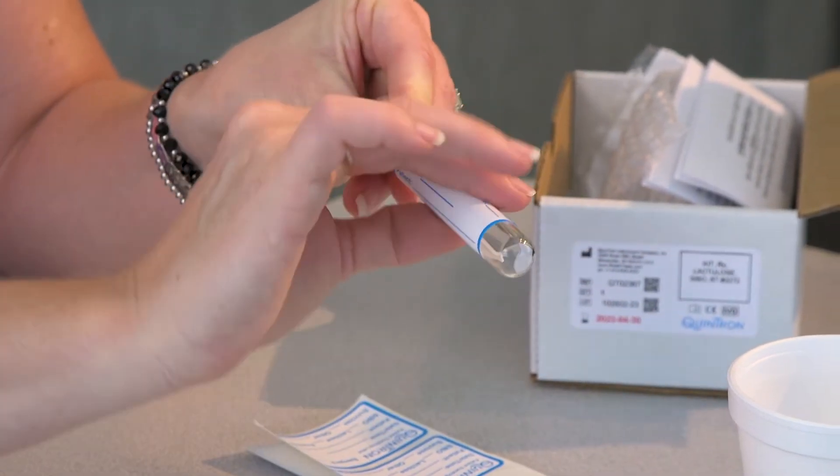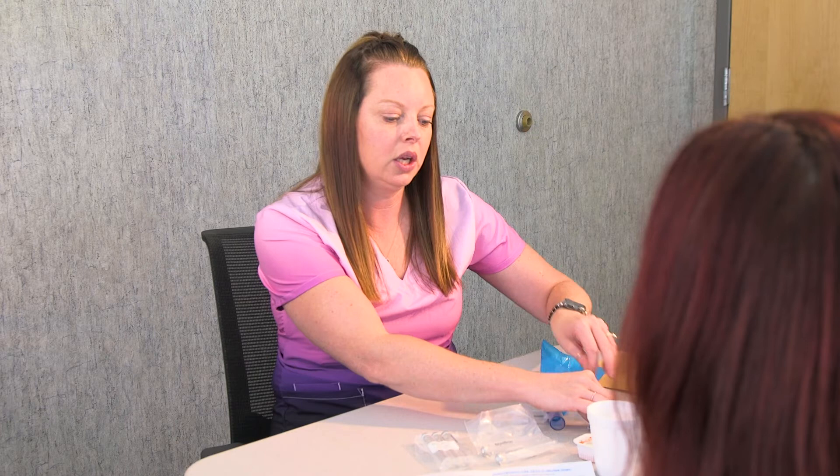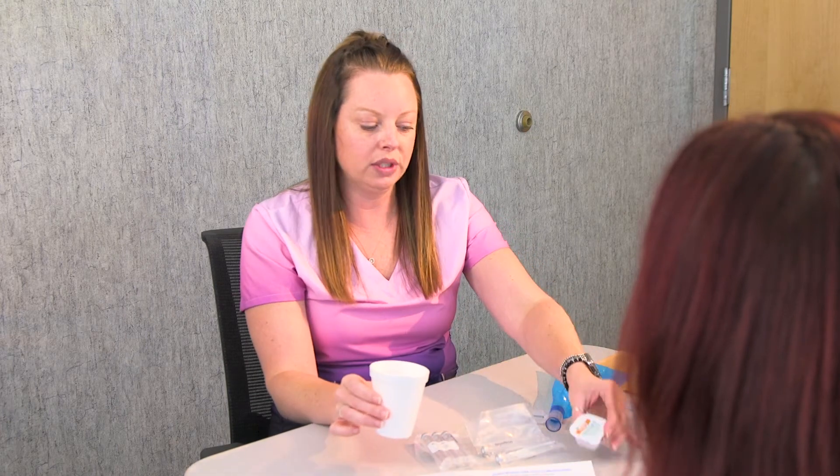After you blow into this tube and put your label on, you will take a cup with an eight-ounce glass of water, dump your packet into it, mix it up, and drink it down completely. Then you will wait 15 minutes and blow into the second tube.